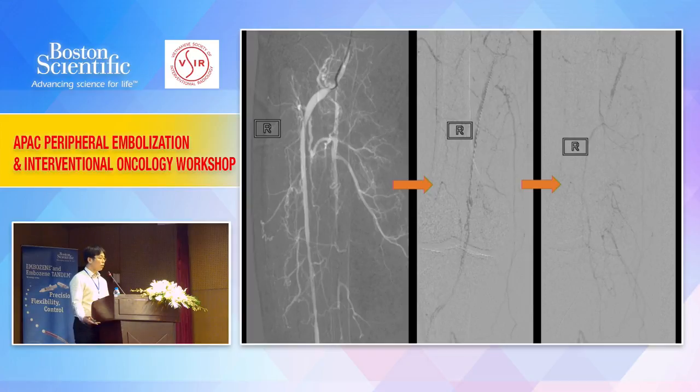So once you get across that, you buzz up and down, and then as we showed there was some inflow, we bring the catheter down on the first picture on the left-hand side. You can see that once the flow improves, you start to see more collaterals. You actually can see that there is more opacification of the collaterals. You can see that there is a filling defect within the tibial peroneal trunk, and there is some kind of distal recanalization of the peroneal artery, although the posterior tibia is completely gone.